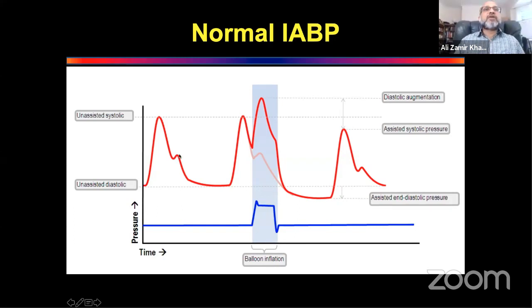That is the start of diastole, and then it traces down, and then the pressure gradually comes down. Isovolumetric relaxation, okay? So same volume and isovolumetric relaxation. And then what a normal aortic balloon pump does is look at the blue tracing. As soon as you come to the dicrotic notch, that means as soon as the aortic valve has closed, you inflate the balloon.